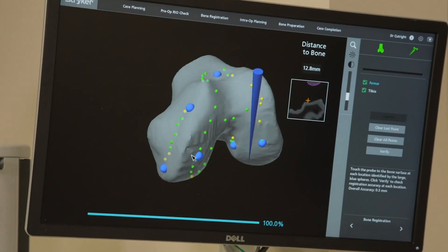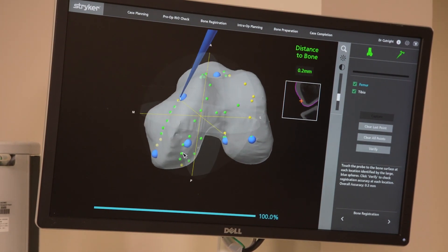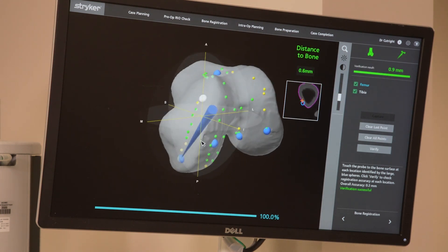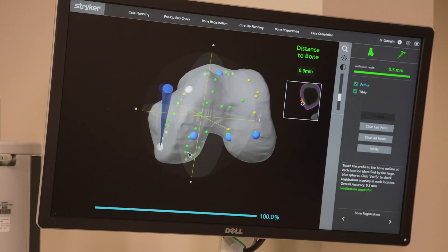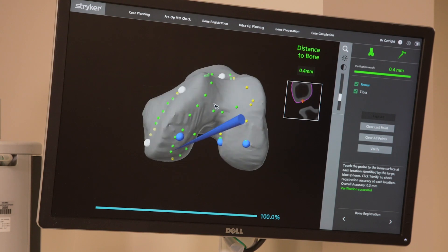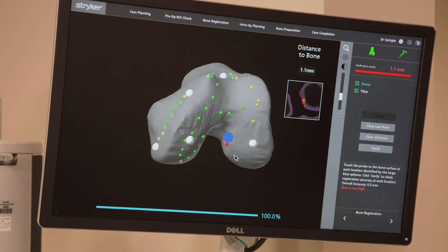And so once that's done — once I've gone over all those points — it puts those blue dots up there. You can see the pointer from my device. I've got to basically put my pointer on those boxes and pop them — I call it 'popping the bubbles.' You pop each one of those, and this confirms that the computer now knows where this bone is.